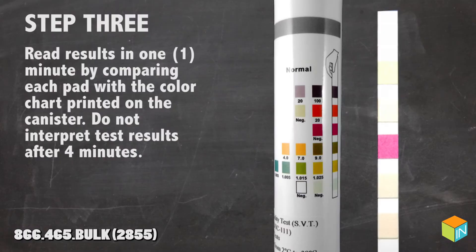Step 3. Read results in one minute by comparing each pad with the color chart printed on the canister. Do not interpret test results after four minutes.